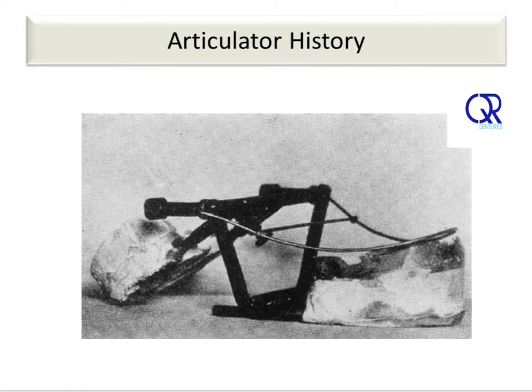In 1898, speaking to a group at Mankato, Monson presented for the first time a method for setting denture teeth conforming to the surface of a sphere based on Bonwill's 4-inch equilateral triangle. Monson had been a student and close friend of Bonwill for many years.